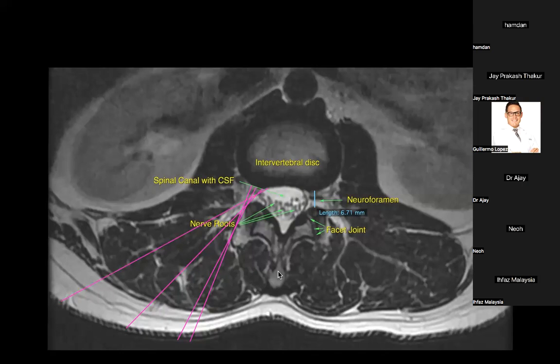Okay. Now look at this. Can you see the spinous process here? Actually, you can measure your distance looking at the herniation here. You can actually see the distance from the MRI also. You can plan it beforehand by measuring the distance from the midline. If you want to target a central one, you can see the distance from the spinous process and you can measure this distance over the skin, from the spinous process to this. You can measure this distance and plan accordingly.